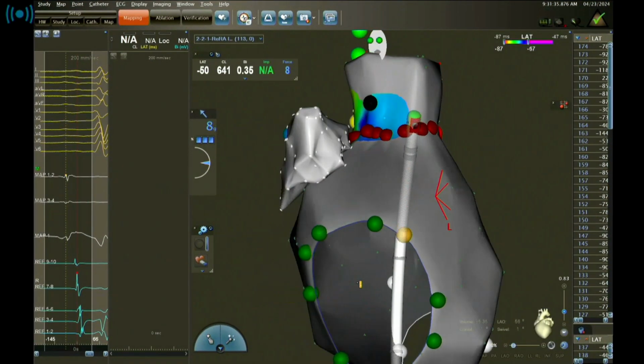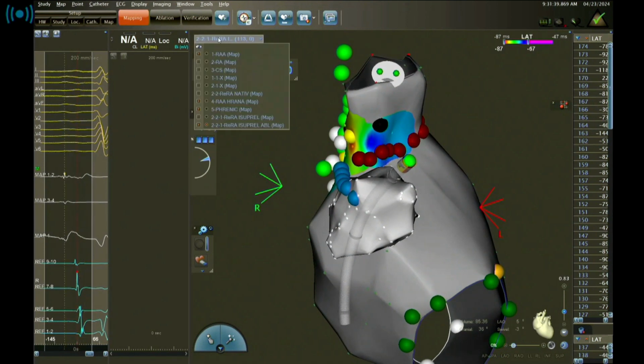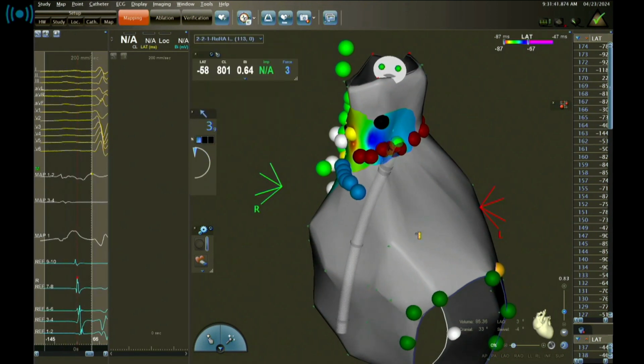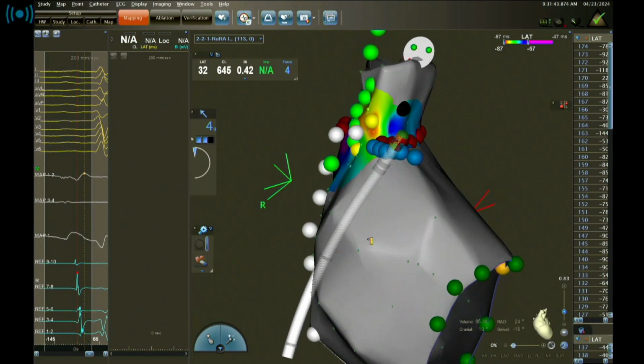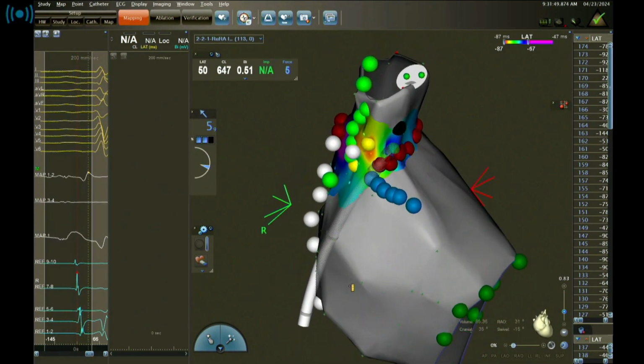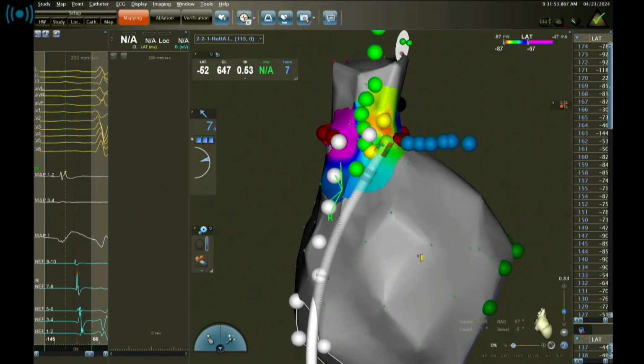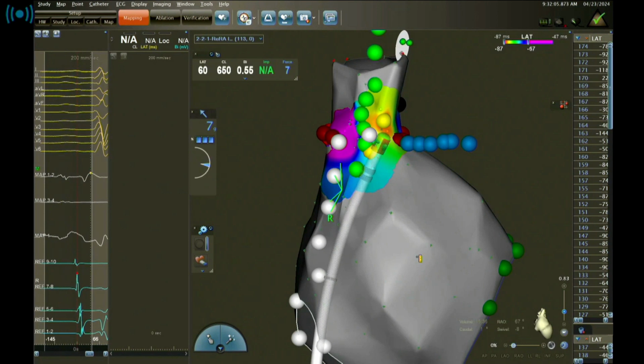Go, more, and please remove the appendage, not to interfere with the nice view of this. All right, so we finished almost the full circle, and the sinus node slowly dropped from this 150 back to 115, which was the baseline rate on isoprel, and now it is even lower.